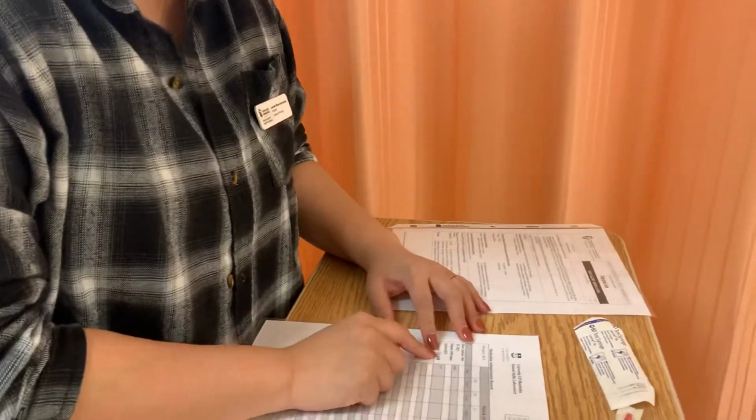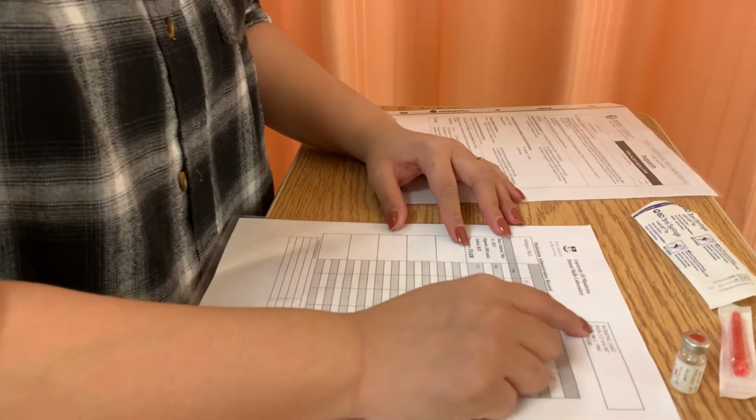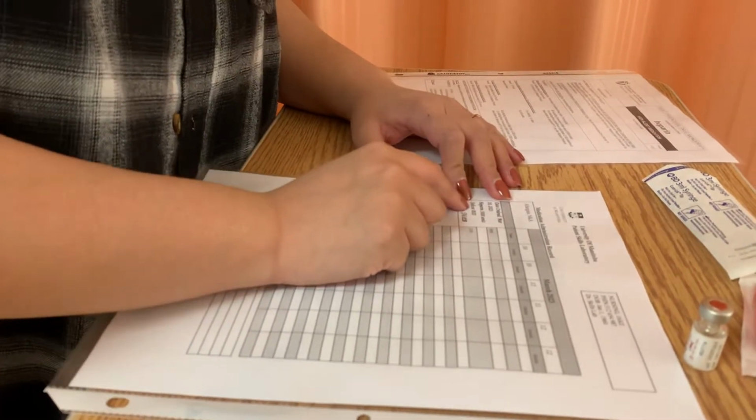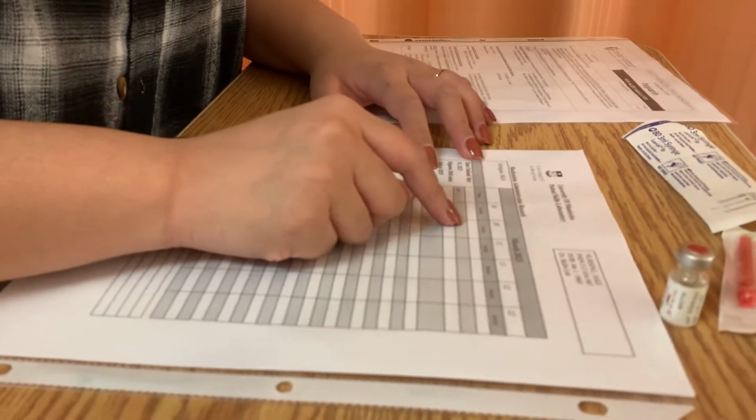So I have my MAR right here. First I'm going to check, okay, there are 2 signatures, 2 verifications, but first I'm just going to check the patient's name, Nursing Jake, okay. I'm going to check the medication. Heparin, dose 5,000 units, route subcutaneous, frequency twice a day, and I'll be giving it at the 9 a.m.